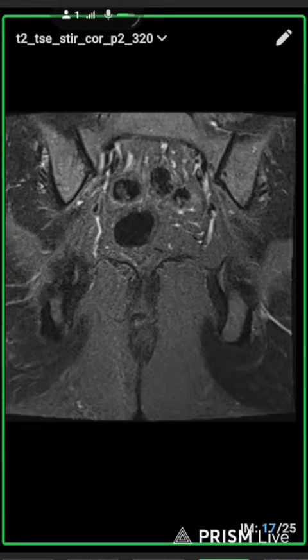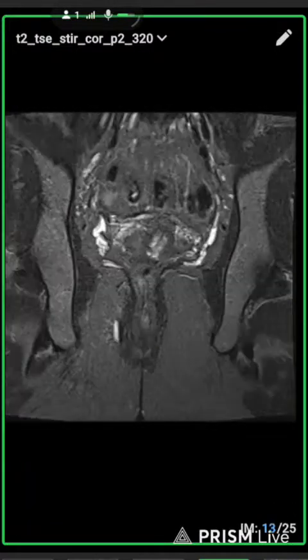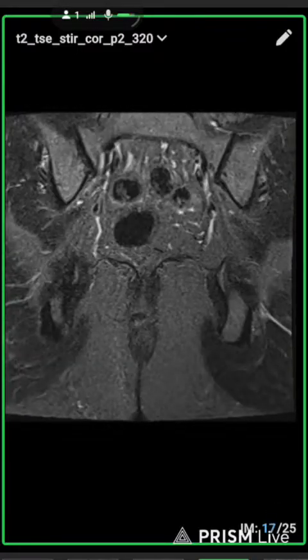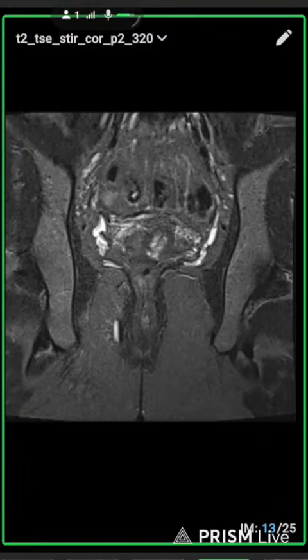So in MRI it will be properly visualized whether the problem is there, or if the patient has that type of fistula, it appears.